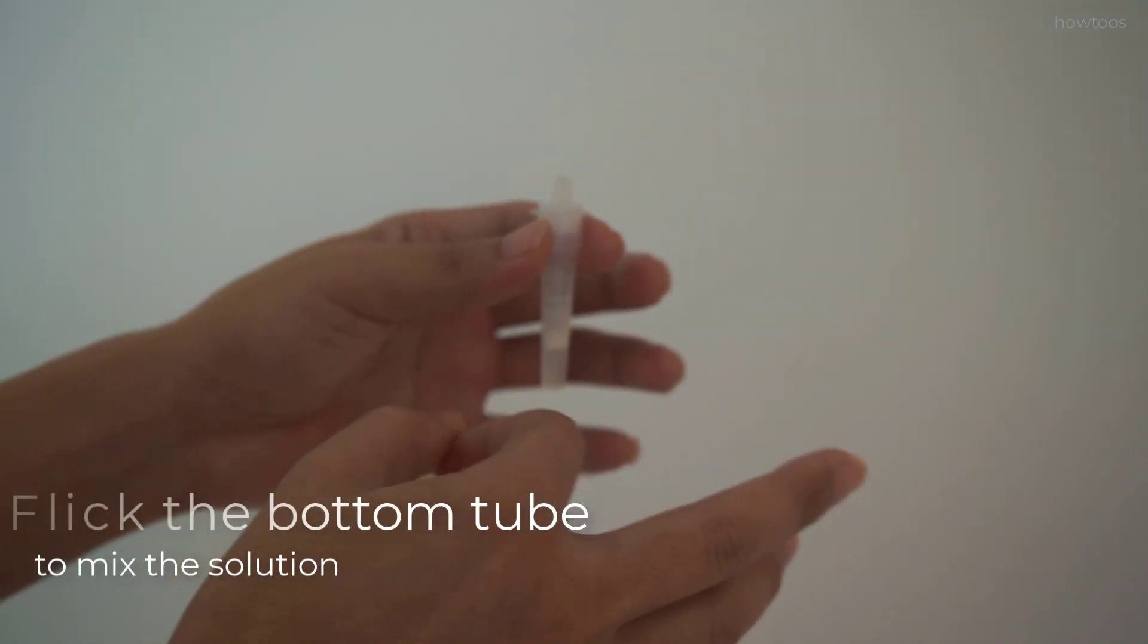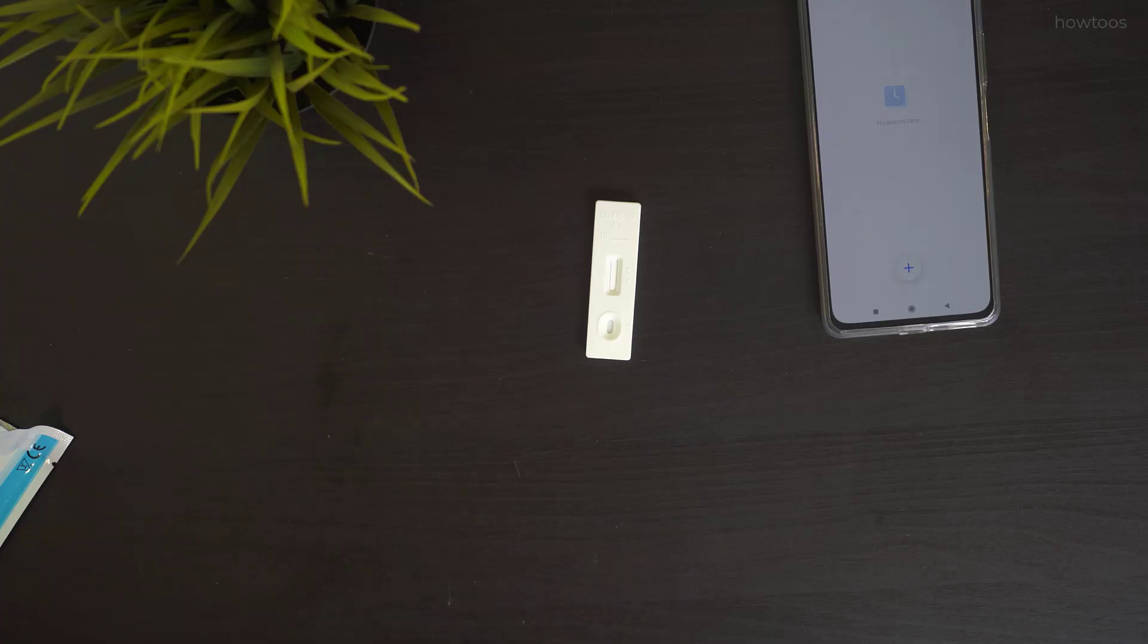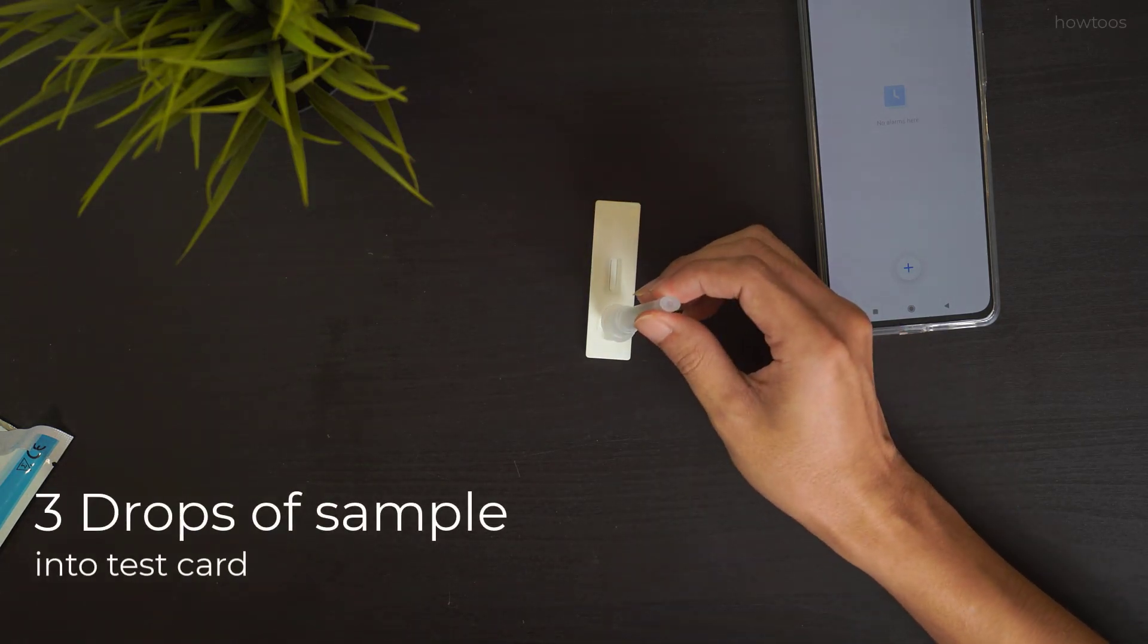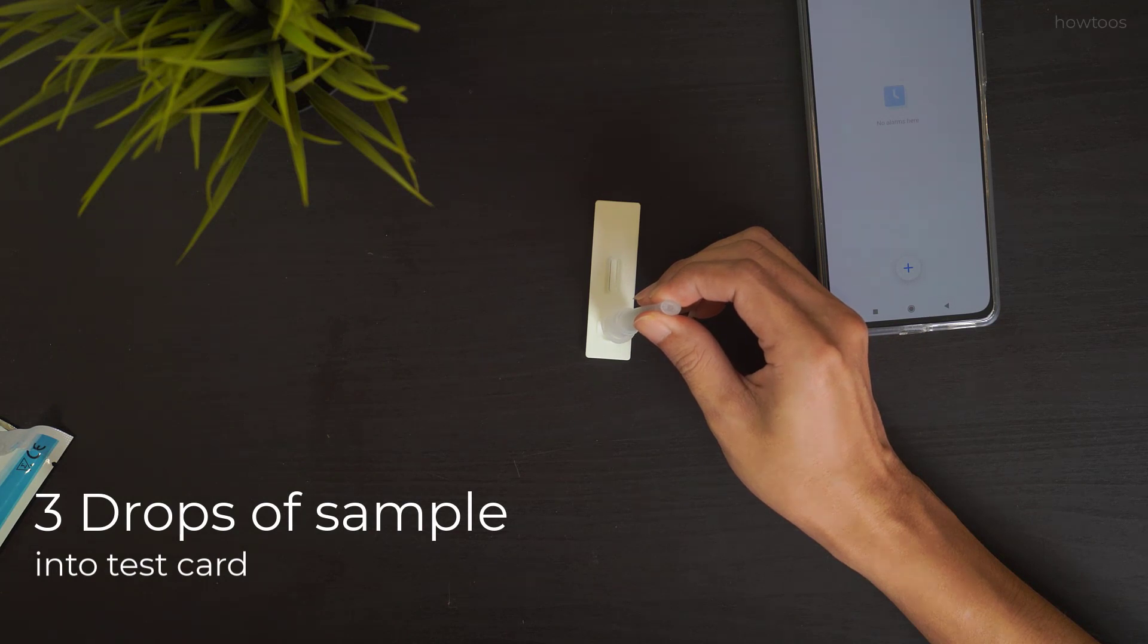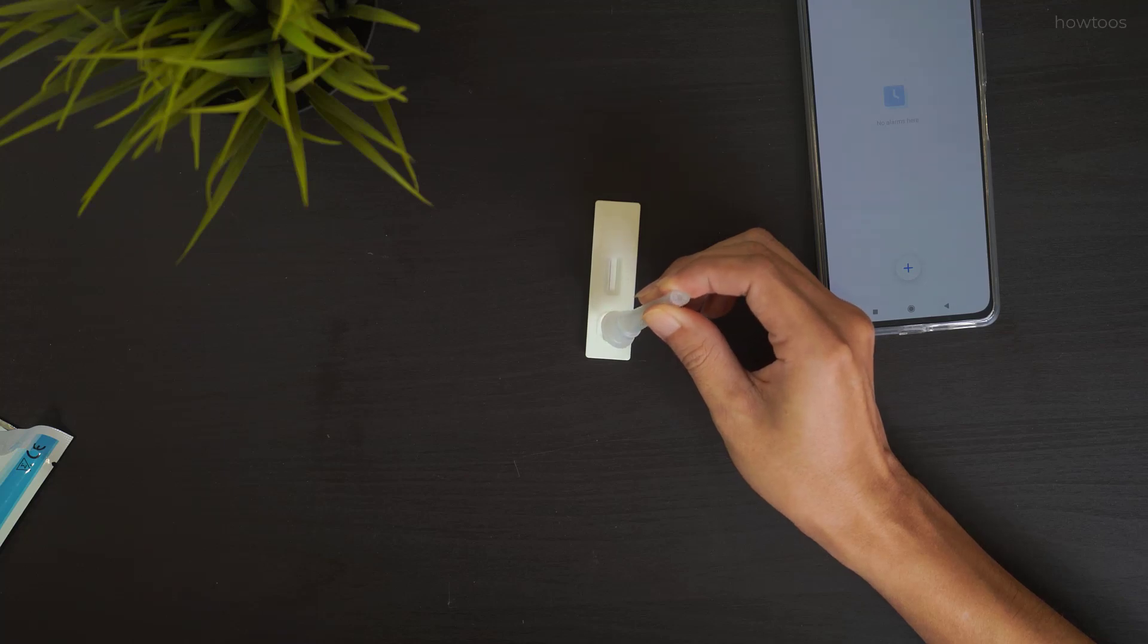Before testing, flick the bottom of the test tube a few times to mix the solutions. Squeeze the tube, hold the tube upside down, and expel three drops of sample through the cover into the test card.